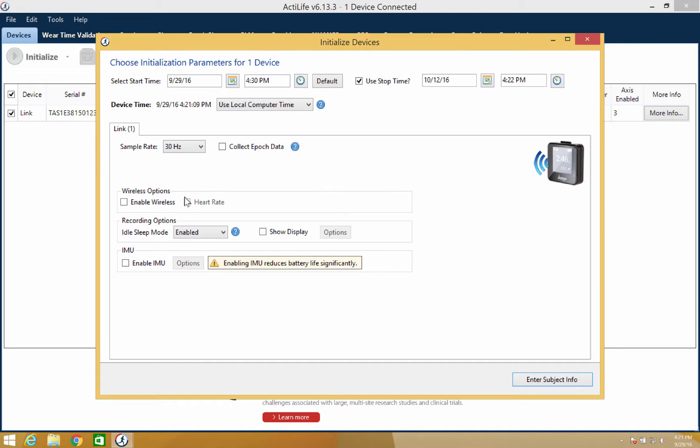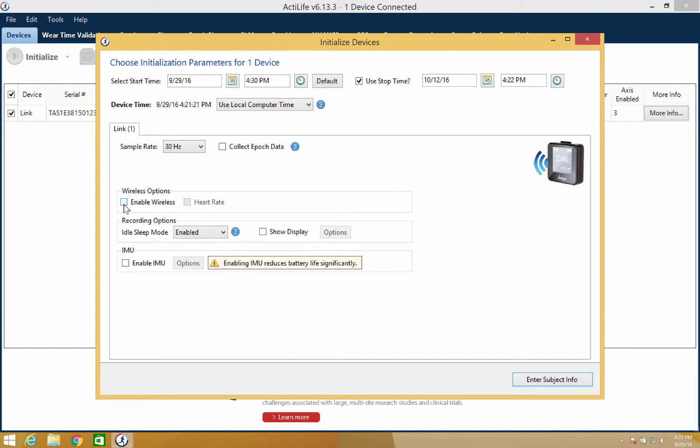Wireless options will enable or disable any wireless features or accessories that are compatible with your device. These options include enable wireless, which will turn on the device's wireless features and unlock the remainder of your options, and heart rate, which will instruct your device to pair with the closest wireless compatible heart rate monitor. Note that you must enable wireless if you plan to use our mobile applications.